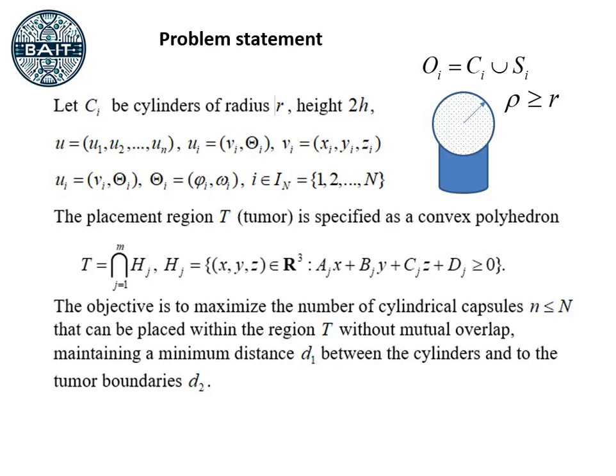We propose a novel geometric modeling framework based on the packing of a composite object: a cylinder representing the physical capsule, and a sphere centered at one of its bases representing the localized radiation source. This modeling approach introduces several key advantages. The model captures directional emission patterns, enabling more accurate dose calculations.